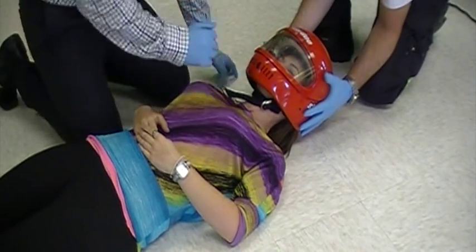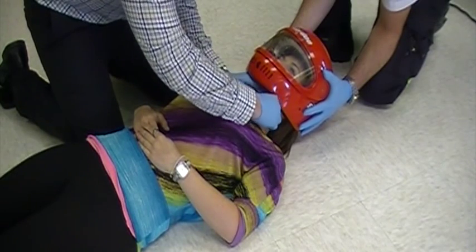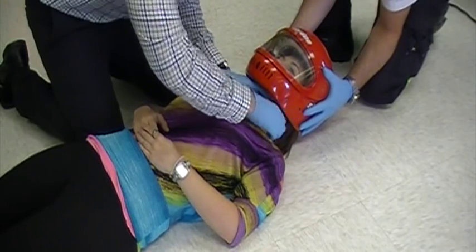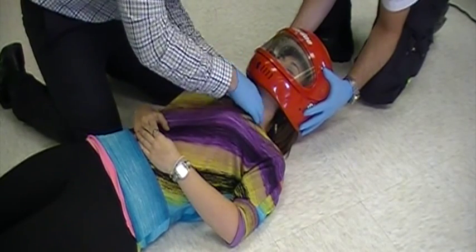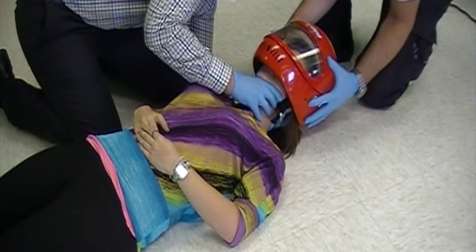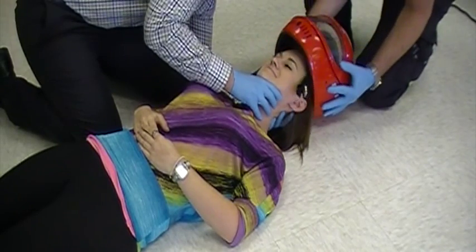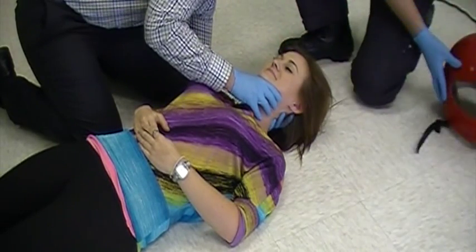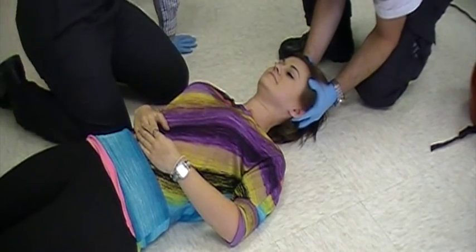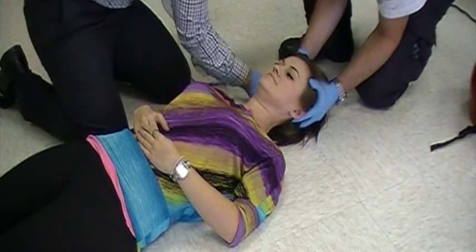Instruct your partner to immobilize the helmet and put the head in an inline position. Remove the chin strap. Obtain spinal control by grasping the patient's mandible and placing a hand under the patient's neck as your partner removes the helmet. Once removed, instruct your partner to obtain c-spine control and place the patient in a rigid cervical collar.